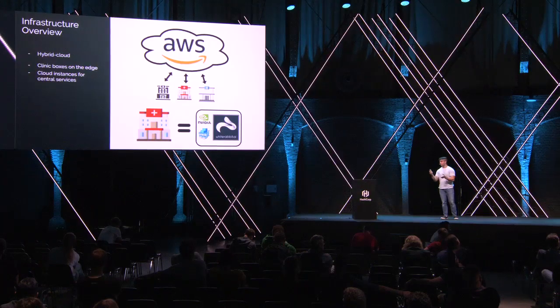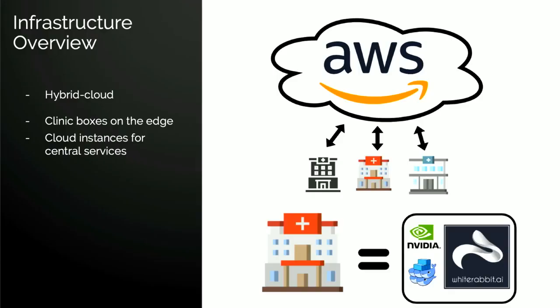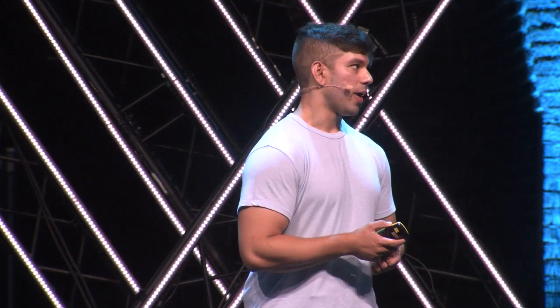You can see there that each of these clinics has a box packaged with the microservices that make up real-time radiology that all run in Docker and have an NVIDIA GPU, because those are required for running inference at the edge in a much faster way.